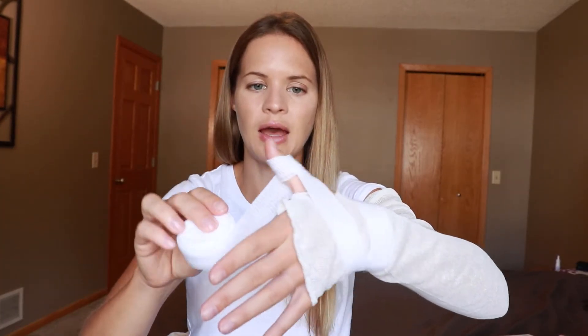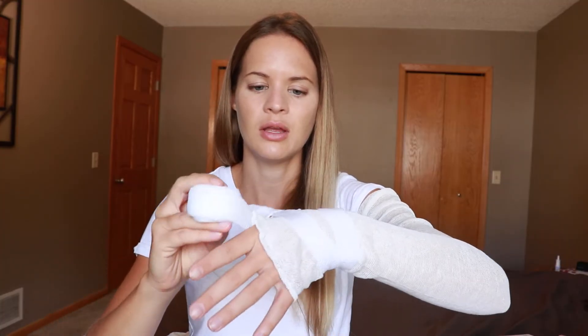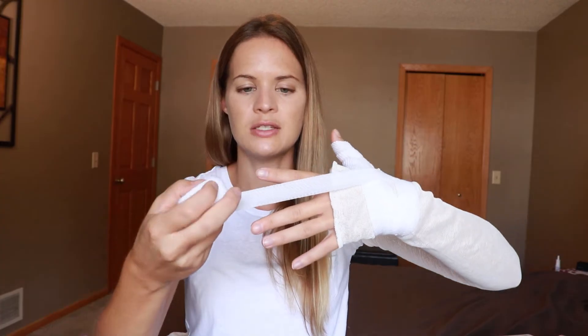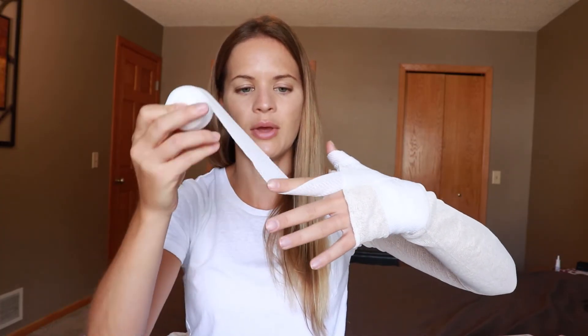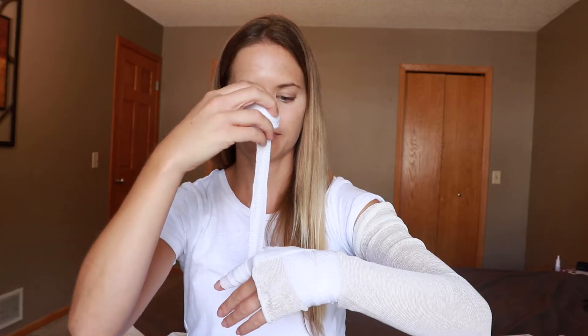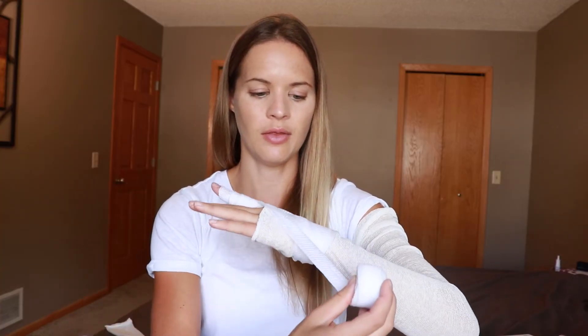Come to the end of the thumb, come around, and then overlap about 50% all the way down until you get to the end. When you get back to the base of the finger, come around the back of the hand, under the wrist, and then come around up to the next finger. Next finger I'm going to do is the pointer — come all the way to the end and then make your way back down. I'll be honest: if you ever drop your roll, you're doing way better than I do. I tend to drop this at least once a day when working with my patients, and that's with two hands. All the way down to the knuckle and then come around the back.